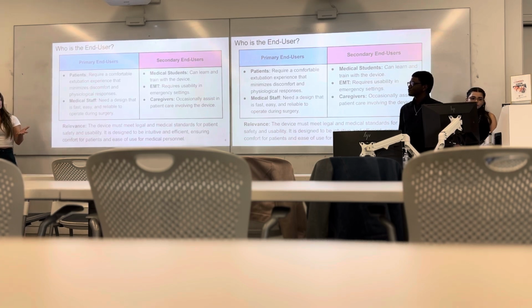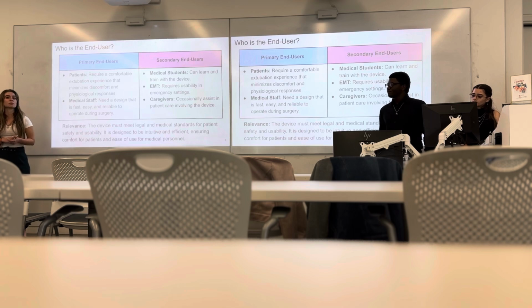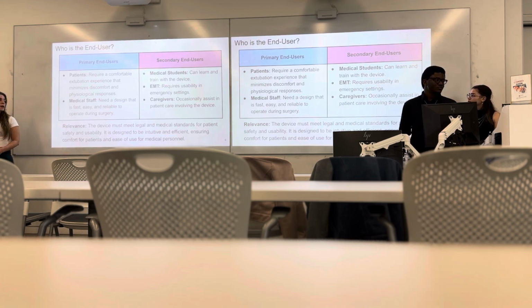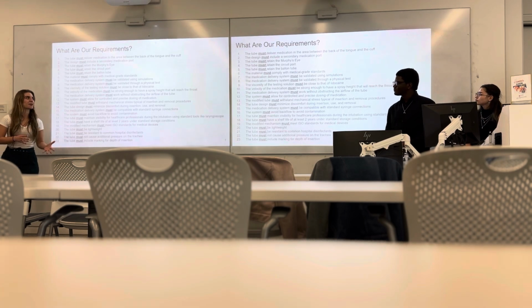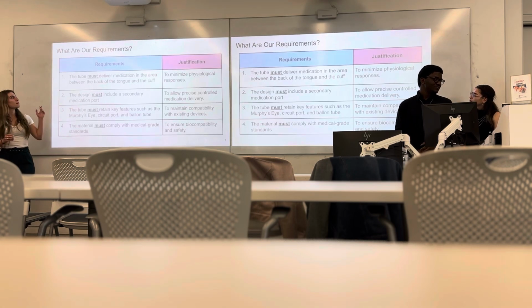And then our secondary end users are medical students, EMTs, and caregivers. And similarly to the medical staff, they need to be able to use that device on their patients during those situations. And then medical students also need to be able to learn and train with it. The relevance is that this device must meet legal and medical standards for patient safety and ease of use for medical personnel. So here are a few of our requirements to go into more depth with them.